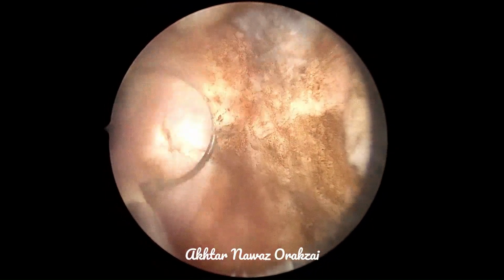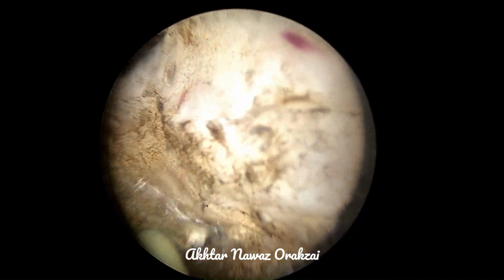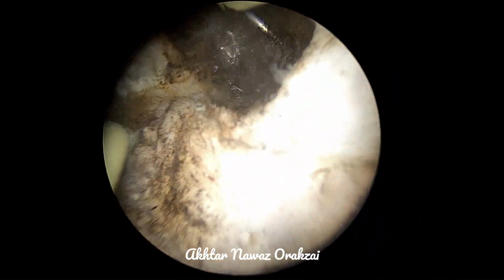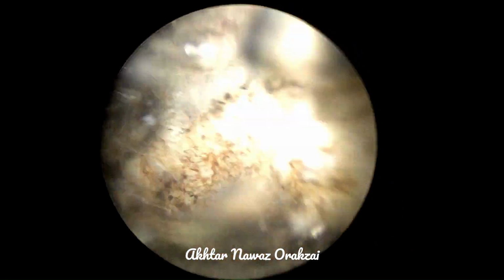However, you can see that resection usually starts at the 4 to 5 o'clock position and then is moved towards the 3 o'clock position or 2 o'clock position. So we go from below upwards.